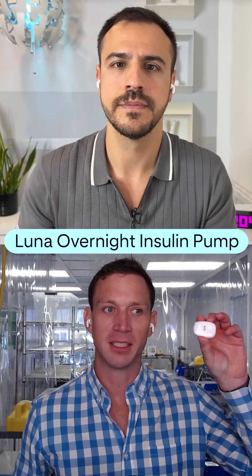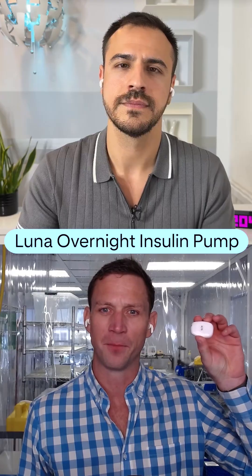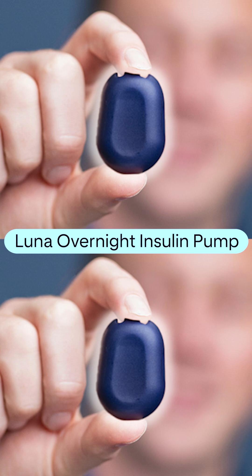This is what it looks like. It's about the size of a Dexcom G6 sensor, if you remember that. This is the pump side of it, and then you'll have the reservoir that attaches to it. It's really small.